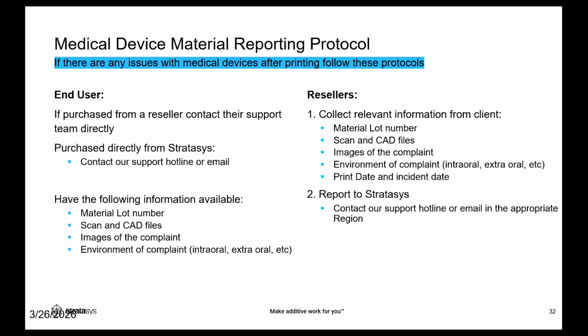So when he says we're cleaning, we're not spending a lot of time. It's not 10, 15 minutes. It's a very quick, easy process, and it's something you're going to be doing anyway if you're DLP printing. I think it's a great advantage having everything fully contained in the J5 printer, where you don't have to mess with any of the raw resins. Again, it's not a long time for this cleaning, so don't get skewed by thinking it's going to take a bunch of time after every print. I just want to put my 2 cents in, if you didn't mind.